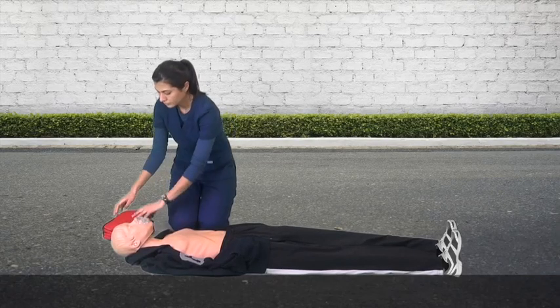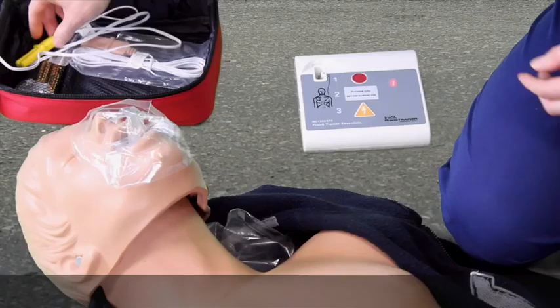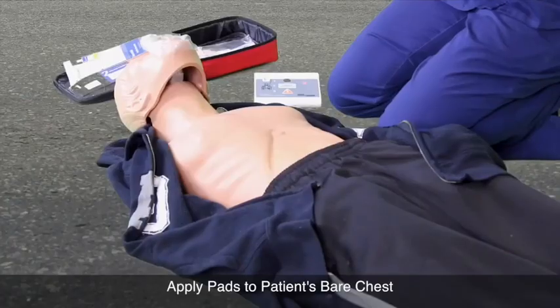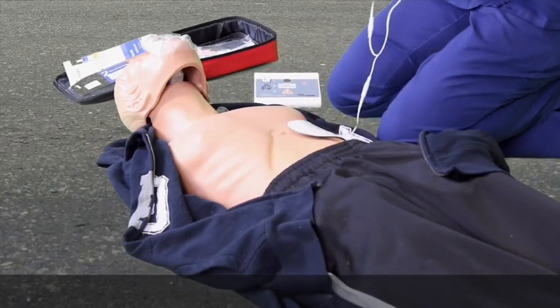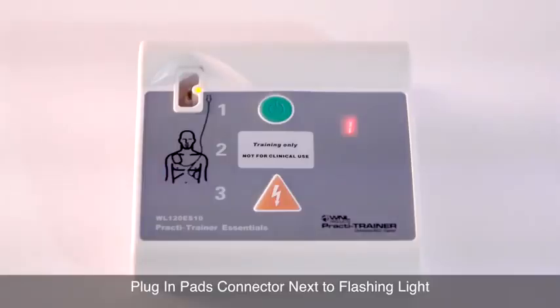The person should open the AED and turn the AED on. The AED will then tell you exactly what to do. Apply pads to patient's bare chest. Plug in pads connector next to flashing light.